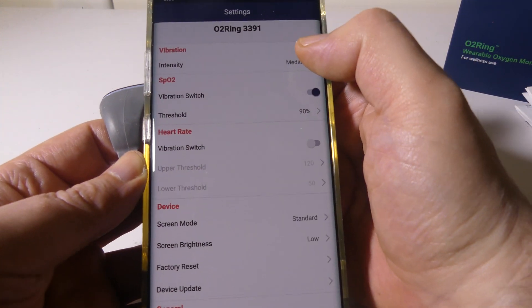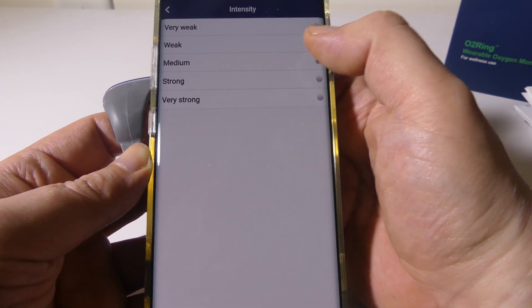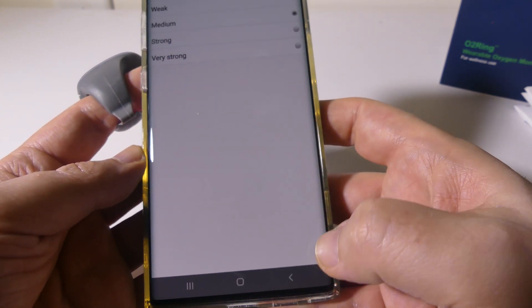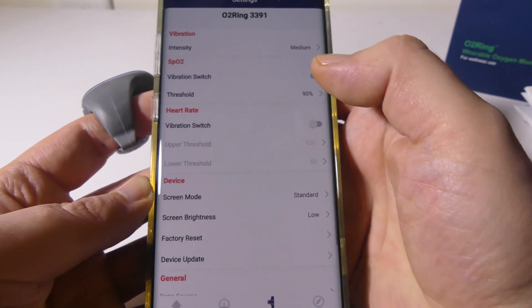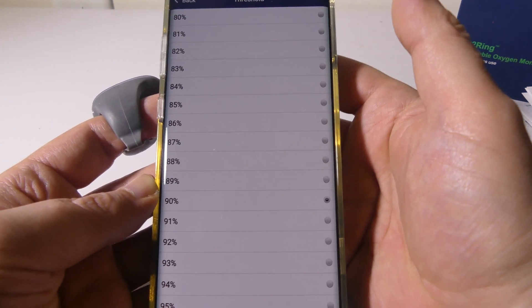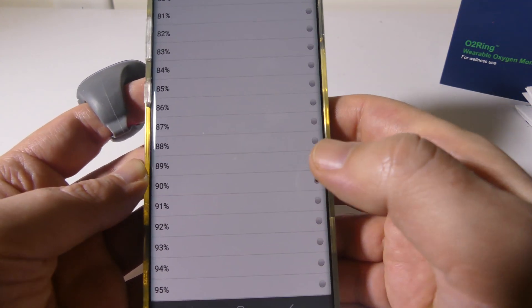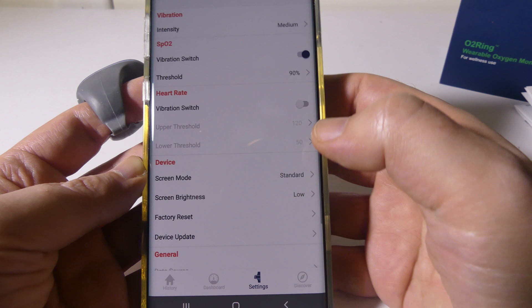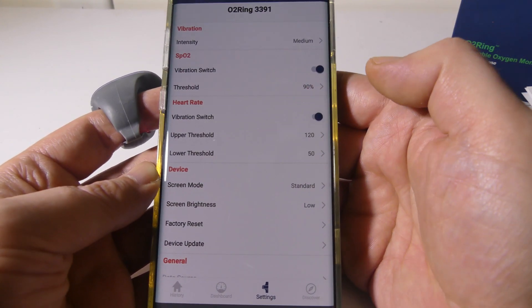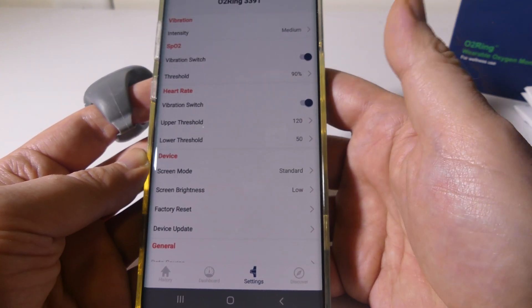In settings, you can adjust vibration from very weak to very strong — very strong is super strong and would probably wake me up at night. The SPO2 threshold is set to 90 by default, so if it drops below 90 it will vibrate, and you can set it anywhere from 80% up to 95%. You can also set heart rate thresholds, defaulting to 120 upper and 50 lower, but those are adjustable.